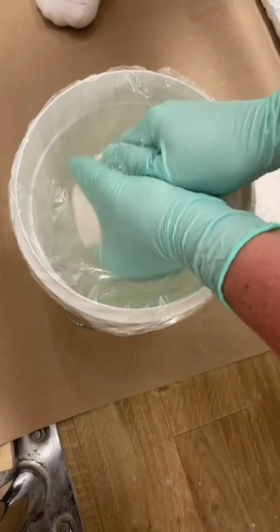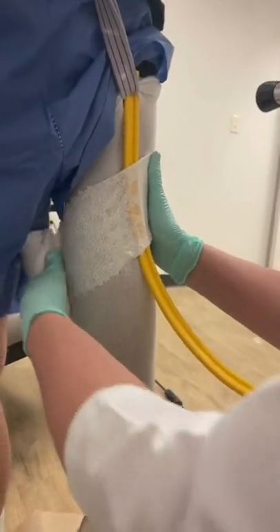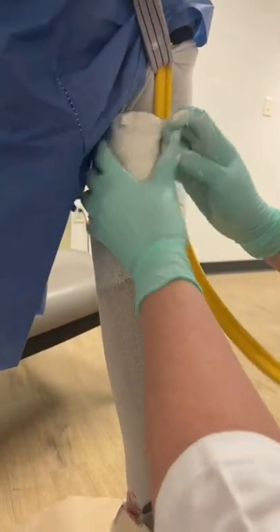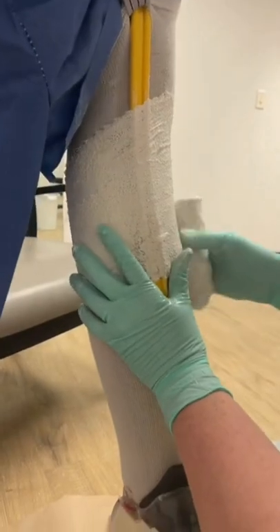Then we get some plaster and we get it wet so we can wrap it around my leg. We wrap the plaster around my leg multiple times. This little yellow guard here is used for later in the video.